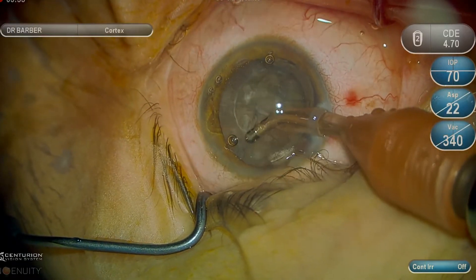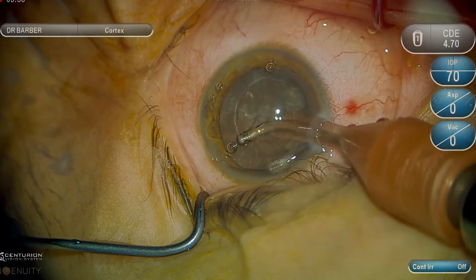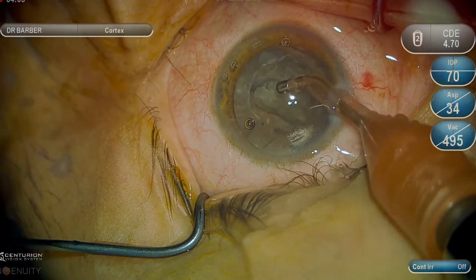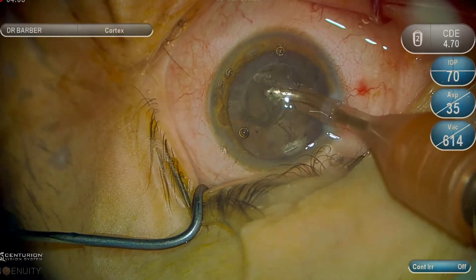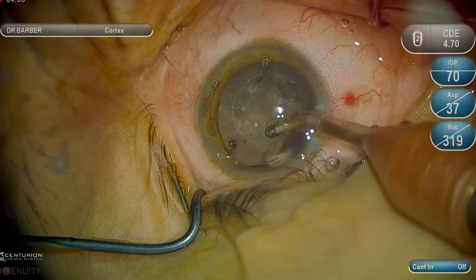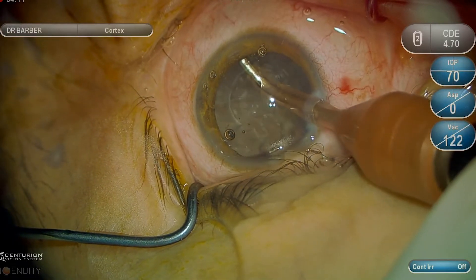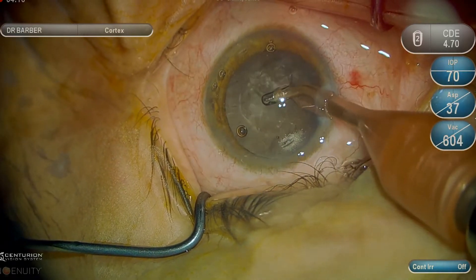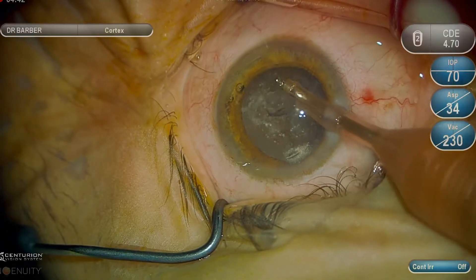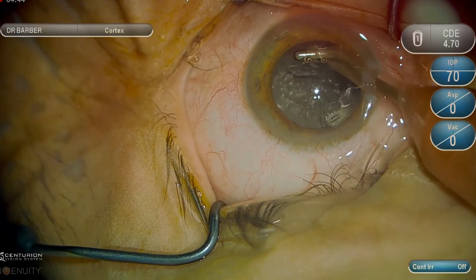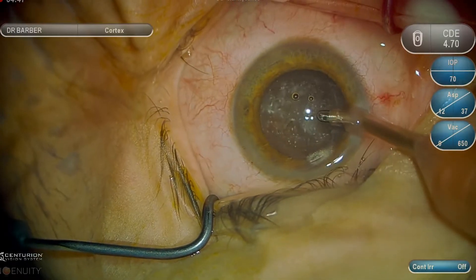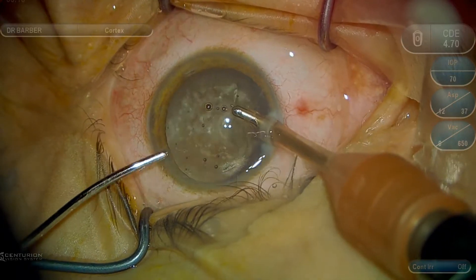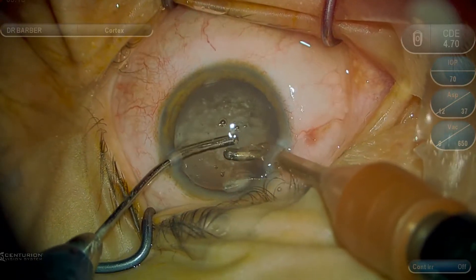Irrigation aspiration is now being performed. Using the microscope to achieve excellent focus of the posterior capsule with the z-axis is quite important. Visualization is difficult, so I decided to switch to a bimanual technique to remove the sub-incisional cortex, as my visualization was quite impaired. By using this bimanual technique, the sub-incisional cortex is easily and safely removed.